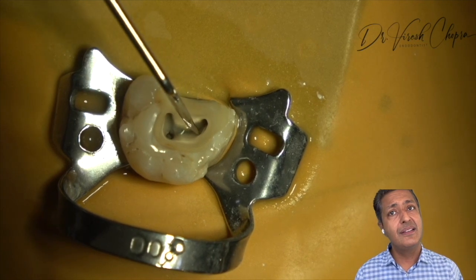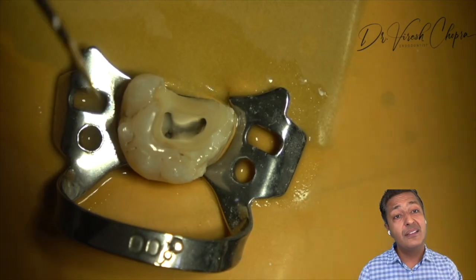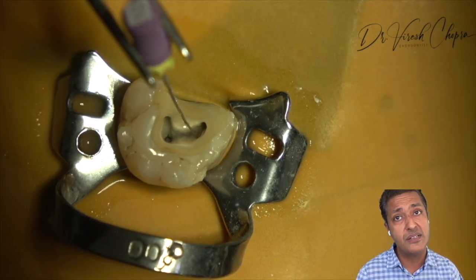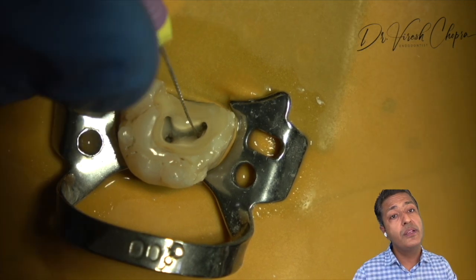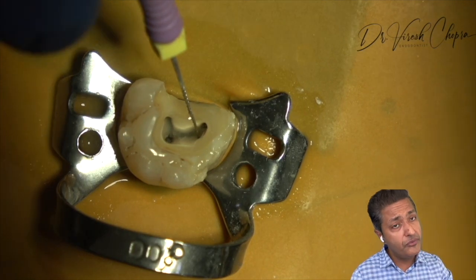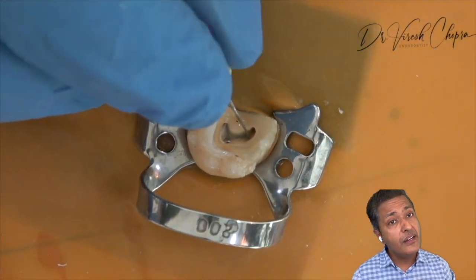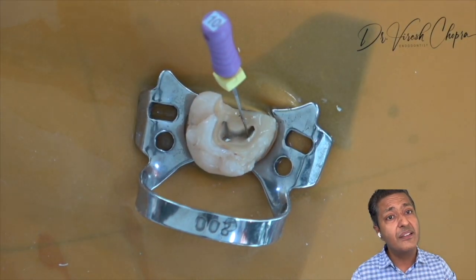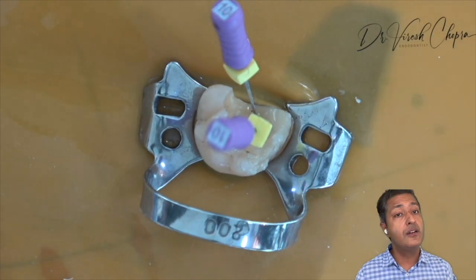Once three canals are seen, check the dentinal map as you can see on the screen. Follow the dentinal map, and this dentinal map will take you wherever any extra canal is present. In this case, there seems to be an extra canal closer to the palatal root canal. Confirm with the DG16 Explorer whether we are finding a catch. Once that catch is seen, then gently place a 10K file and again with a watch winding motion, gently place the file inside. Again I am saying no active cleaning to be done here, no force to be applied.